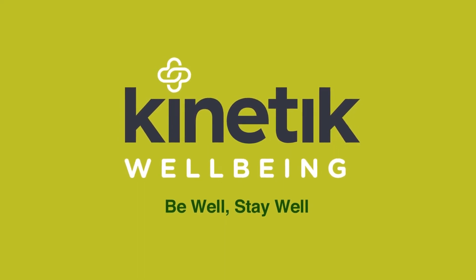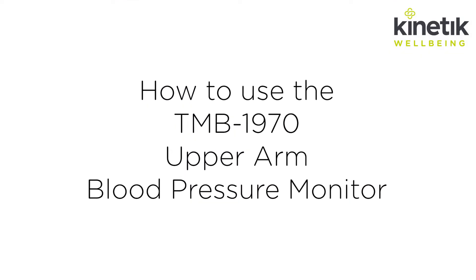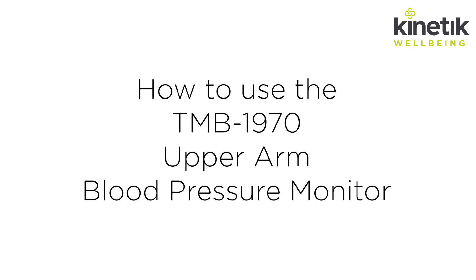Kinetic Wellbeing have developed a range of accurate, simple to use and affordable blood pressure monitors. Here we will show you how to use the TMB1970 Upper Arm Blood Pressure Monitor.